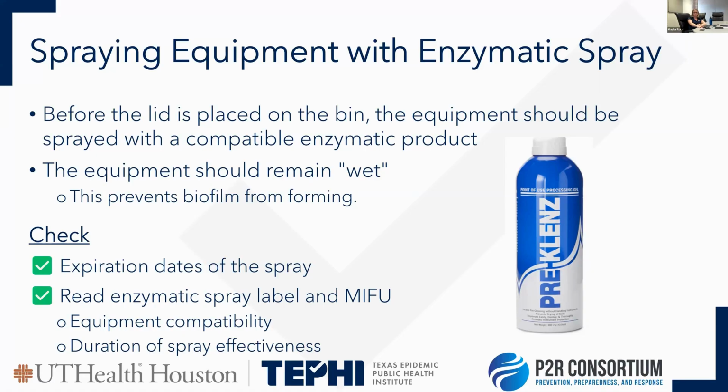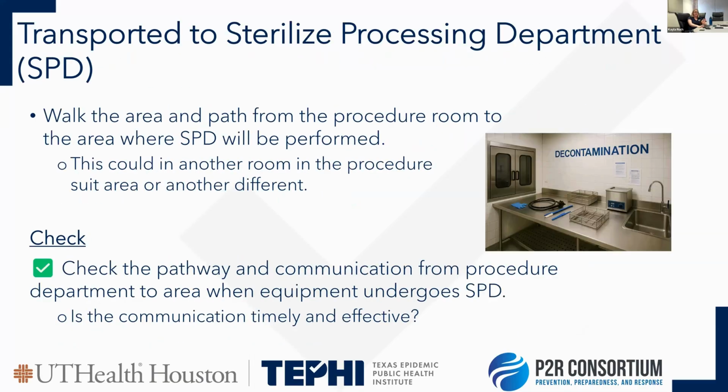Some enzymatic sprays are only good for 12 hours. Some are good for 36 hours. What does the MIFU of your enzymatic spray at your organization say it's good for? Make sure that you know what's being used at your organization and that staff knows what's being used and how it should be used.